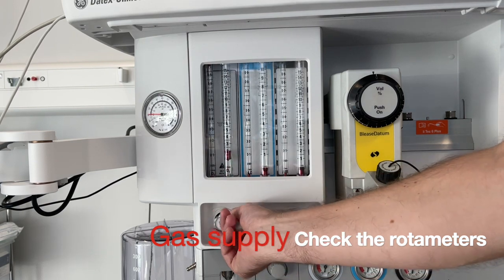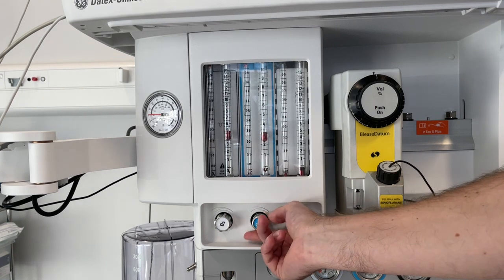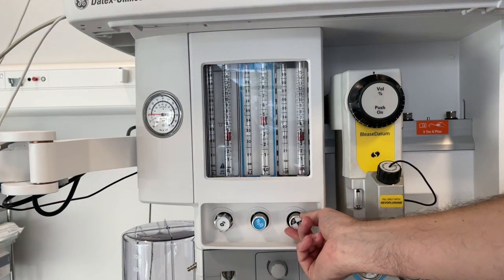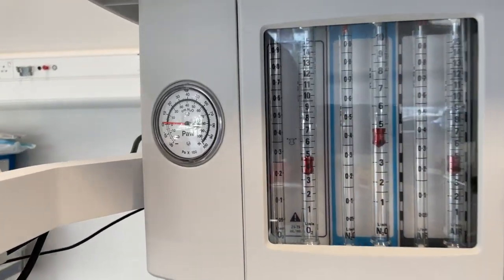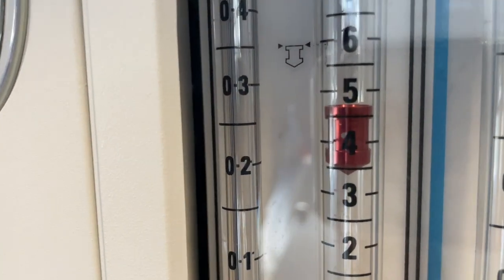Ensure that the rotameters are working correctly by turning them all on and watching the bobbins rise. Pay close attention to the white dot on each of the bobbins — it's a visual indication that the gas is actually flowing.